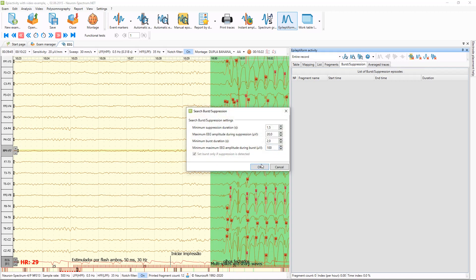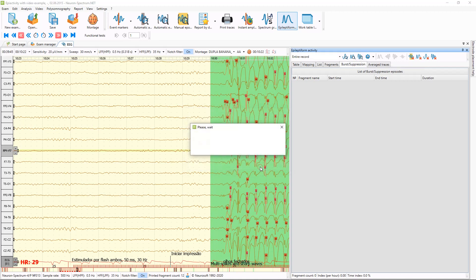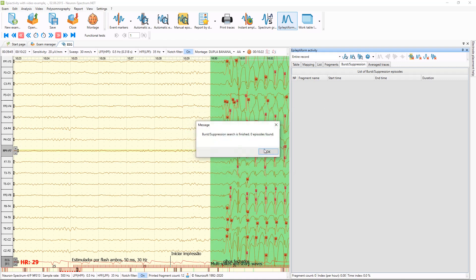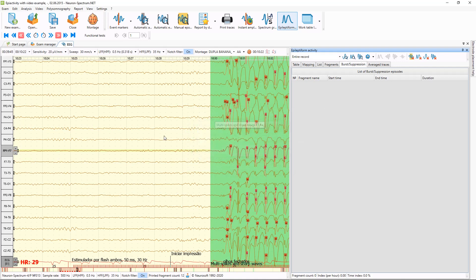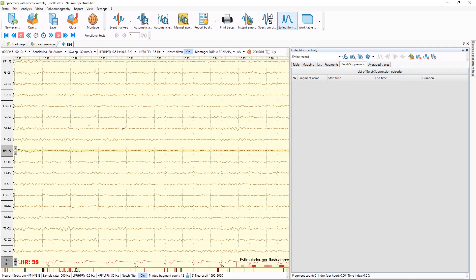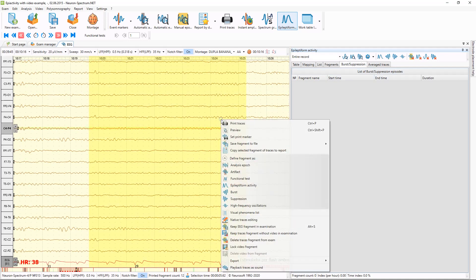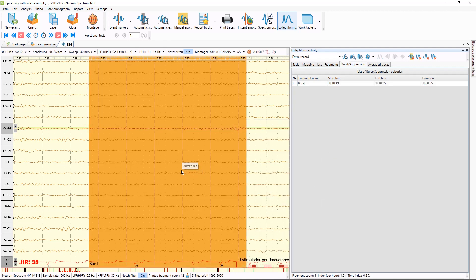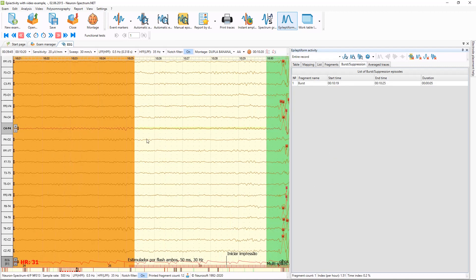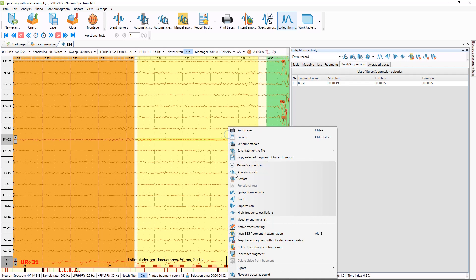And burst suppression episodes — we can also use automatic searching of such episodes, or we can mark them manually. On this examination there are no burst suppression episodes, but we can still mark them manually, like this — marking a burst and a suppression.